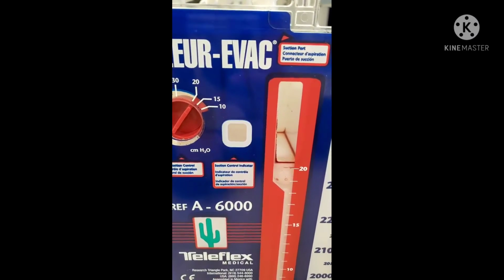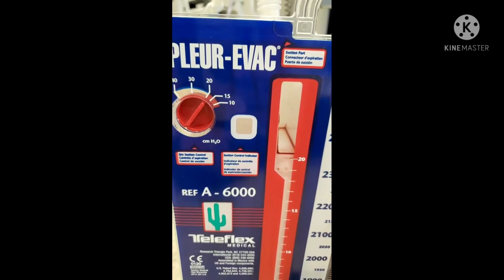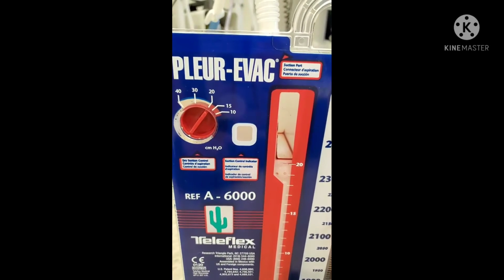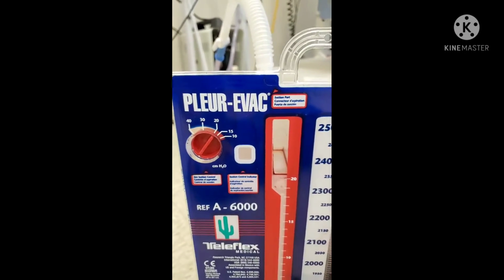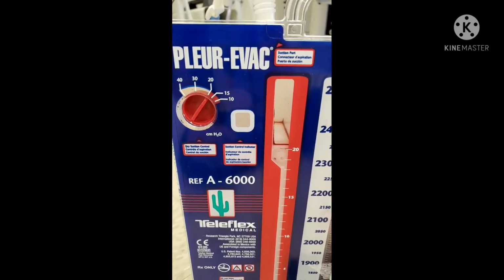You see that there's a little window there and there's no orange bellow. That could just mean that my provider has ordered to stop suction. But if my patient is supposed to be having suction, this orange indicator should be there. And as long as this is set at the 20 and the orange indicator is there, that means I'm suctioning appropriately.